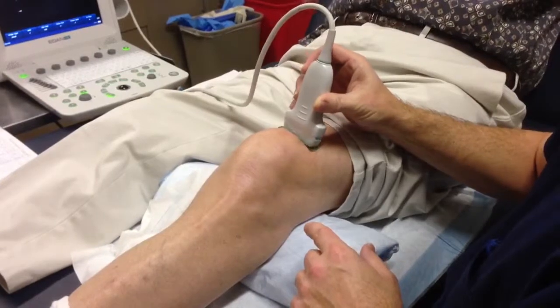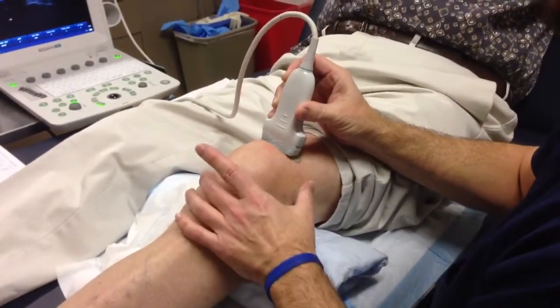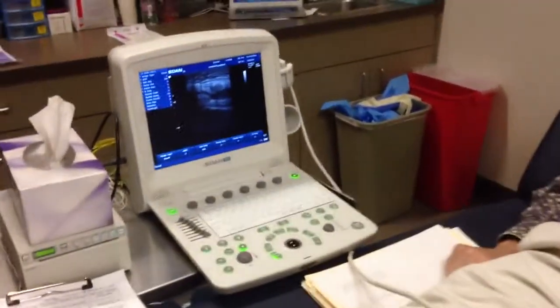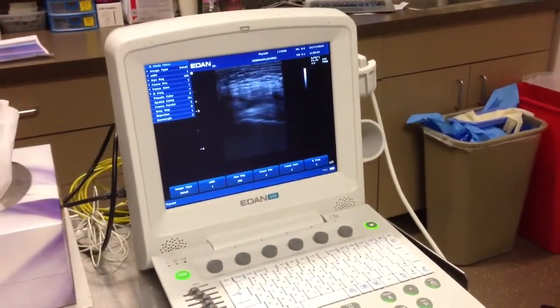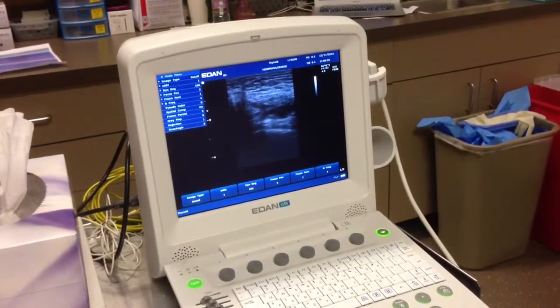So now if I go to the short axis, I can find that same capsule and again I can squish it. There's that squishiness again, and if I squeeze the knee it fills the capsule — you can see the dark shadow is fluid.